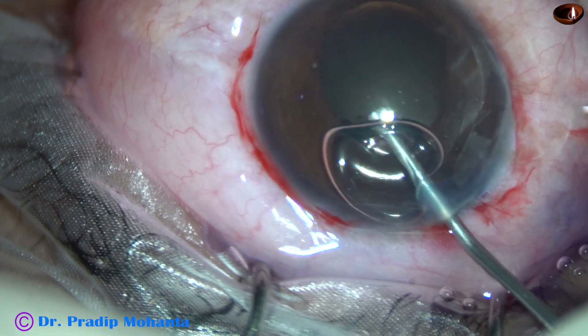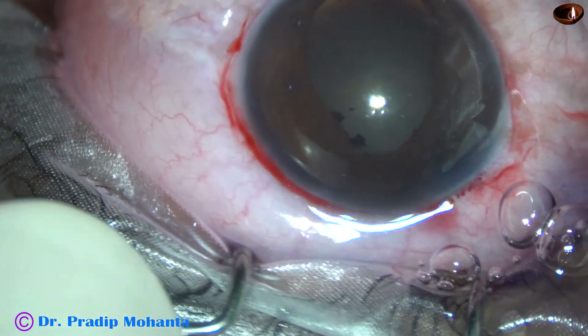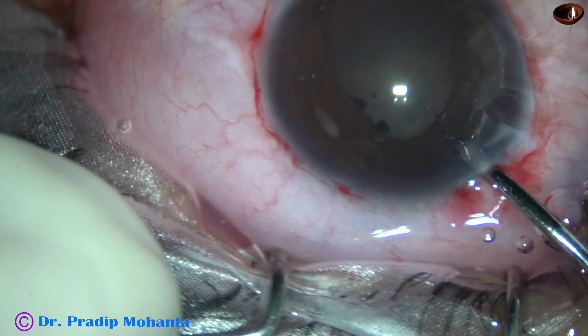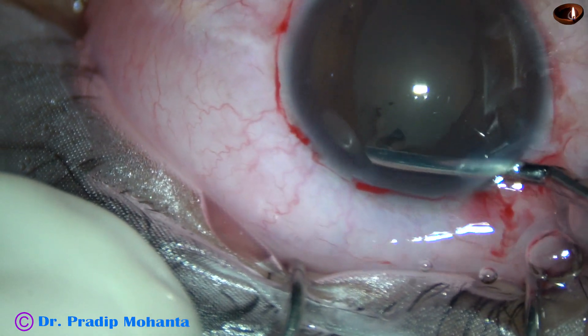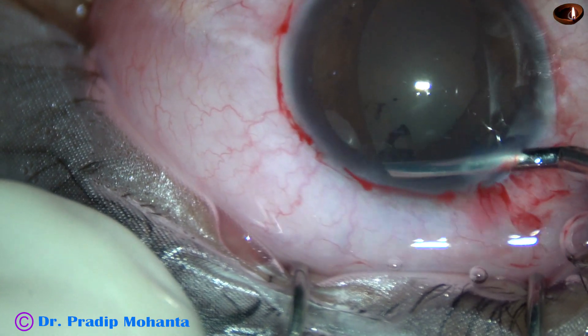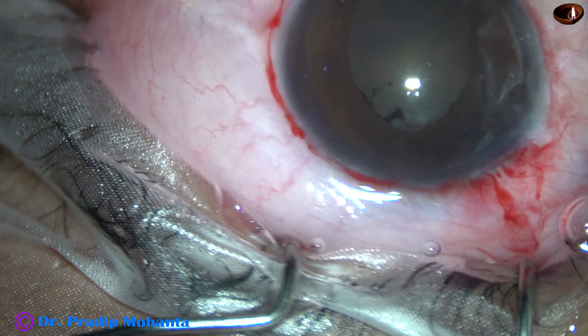After staining the anterior capsule with trypan blue dye, visco is filling up the anterior chamber. An iris spatula is being used to break the posterior synechiae.